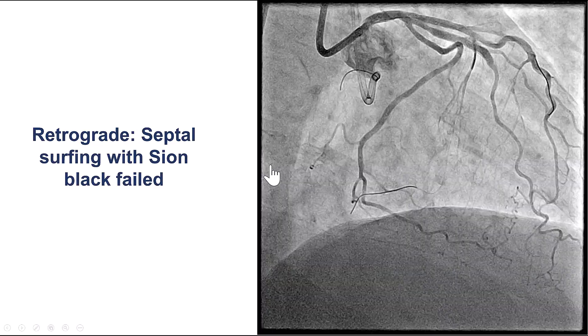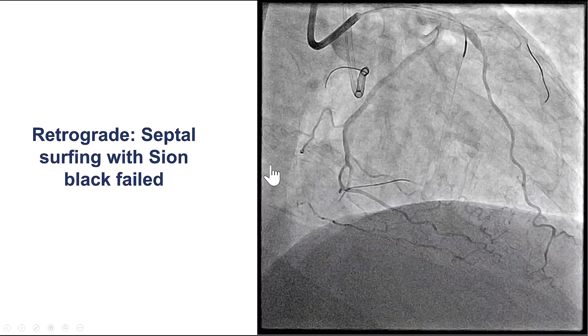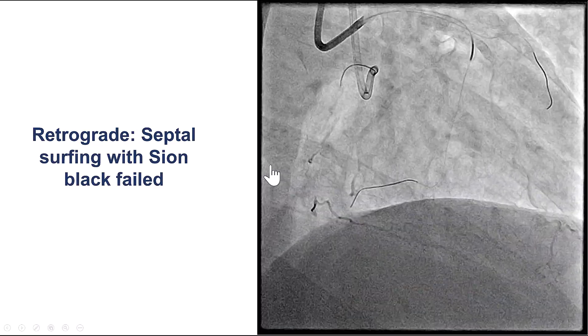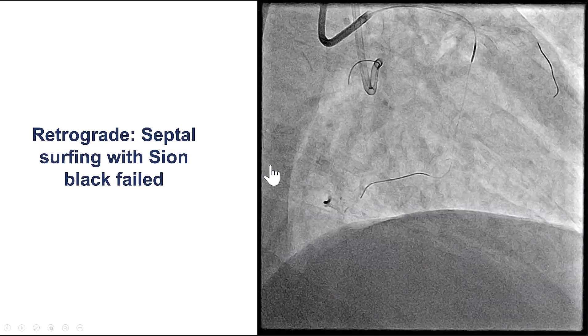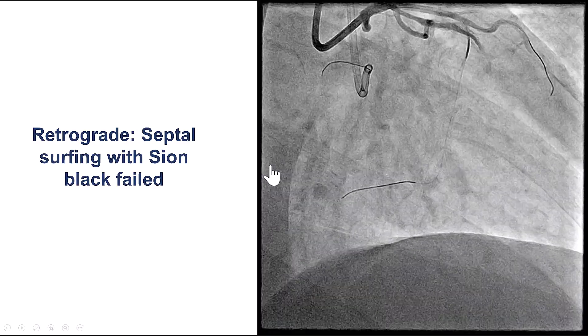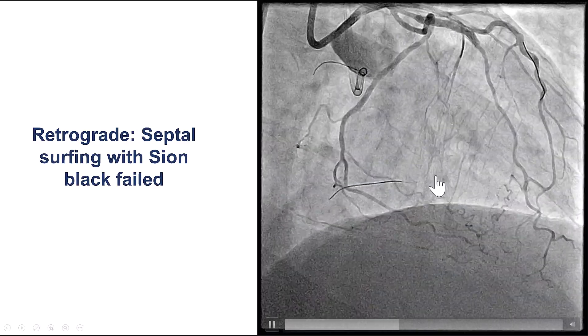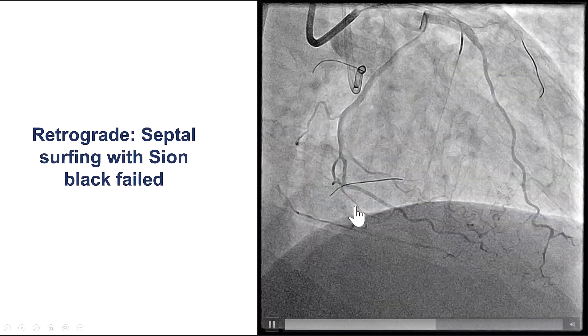We then tried retrograde through the septal collaterals, performing both surfing as well as contrast-guided techniques, but once again we were unable to cross into the PDA.